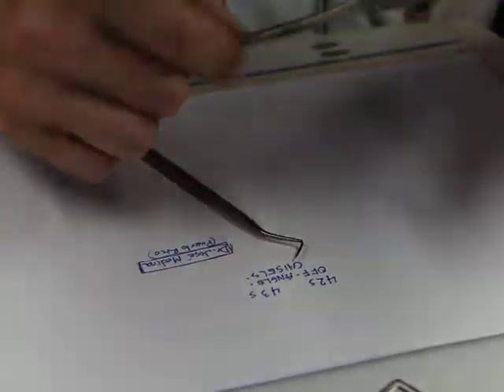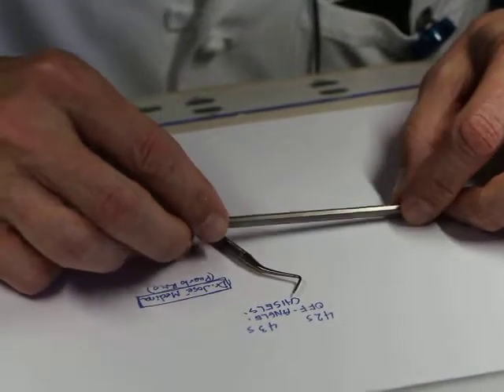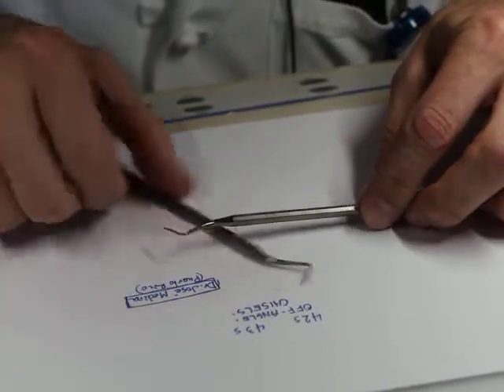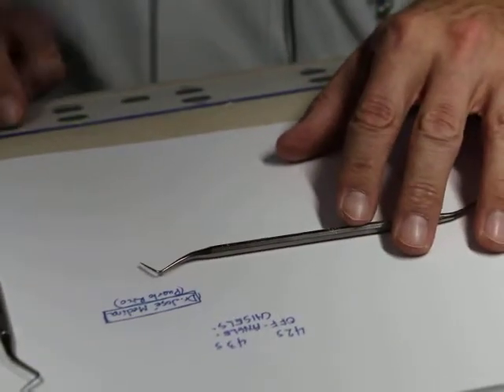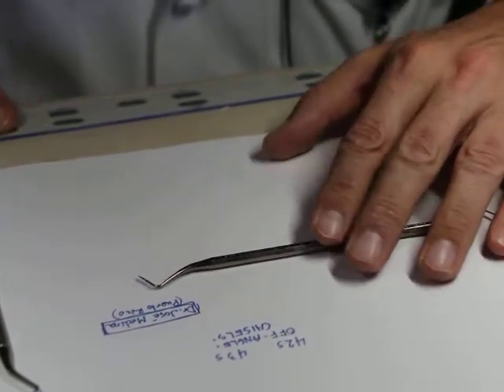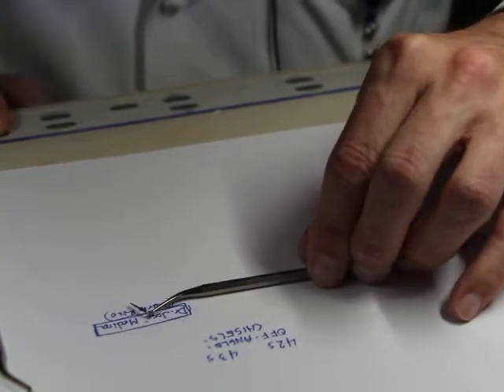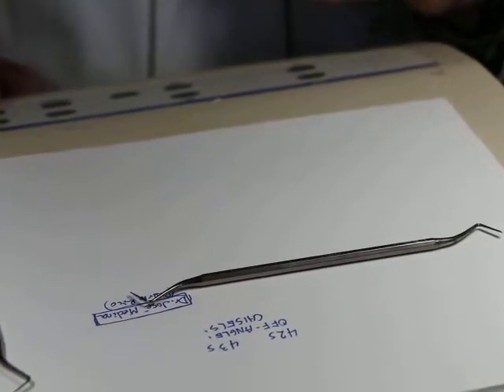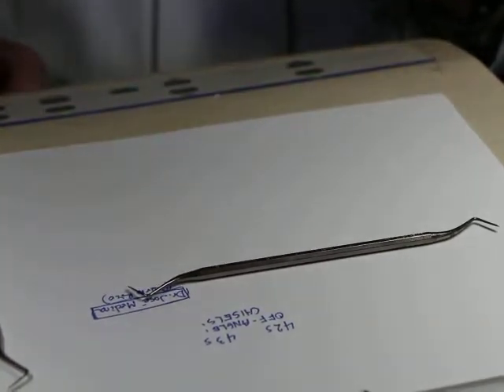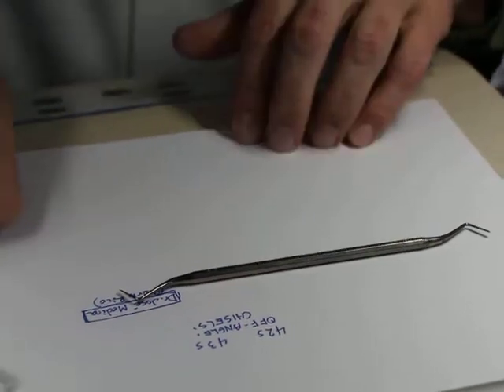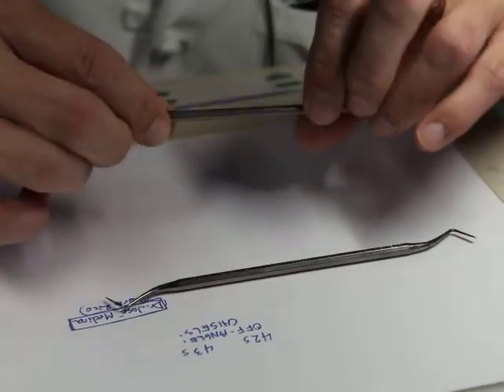Alright. So, if you look at the side of the instrument, it should say Trubow 42S. If you look really closely, hopefully it says something like that. And then the other one says 43S.